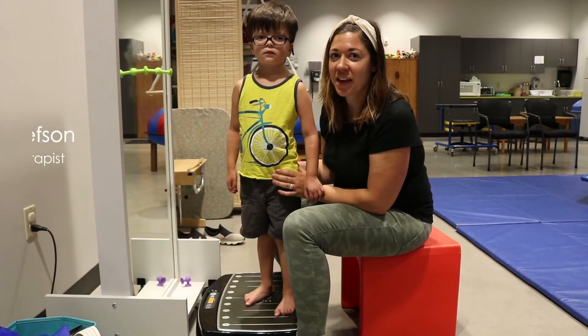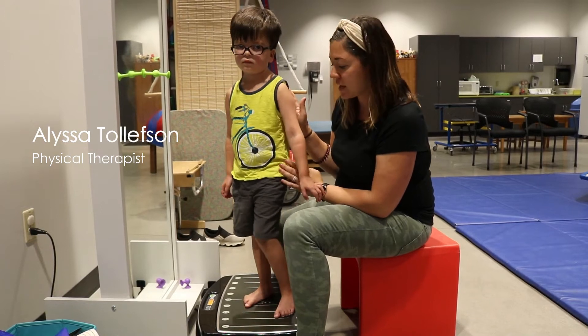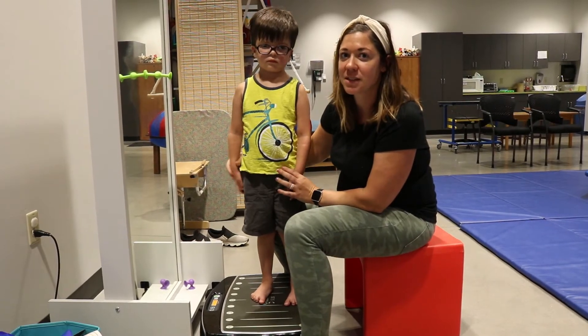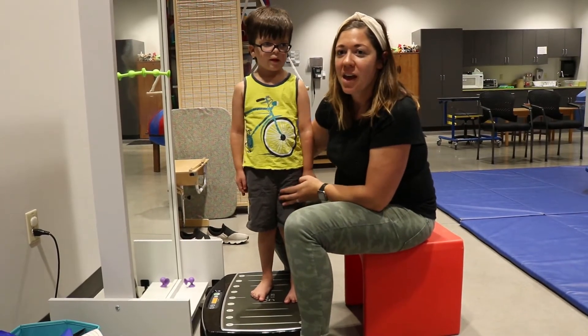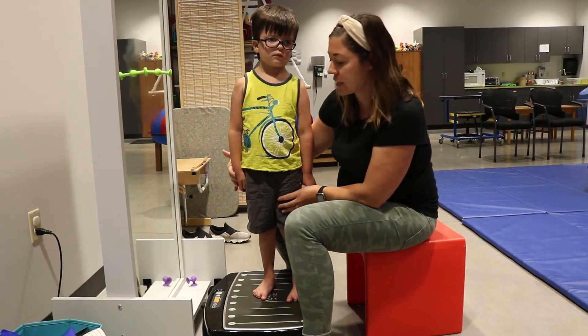I'm here with Elliot. We're using the Galileo vibration plate today. Different frequencies focus on different things. We're going to start with a lower frequency to work on increasing his body awareness and proprioceptive input, and just waking up those muscles to prepare for some of our balance activities later.